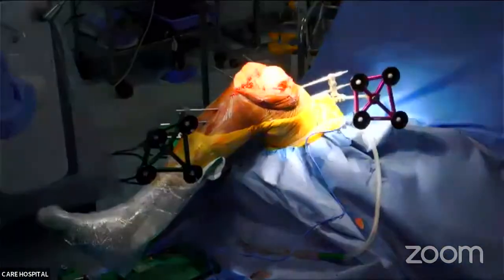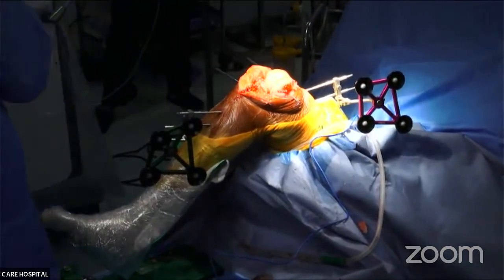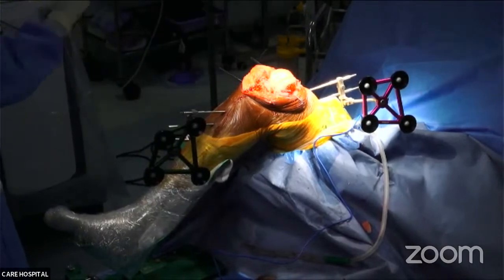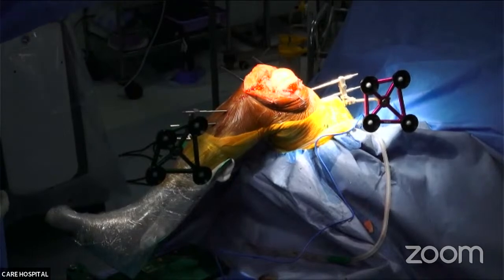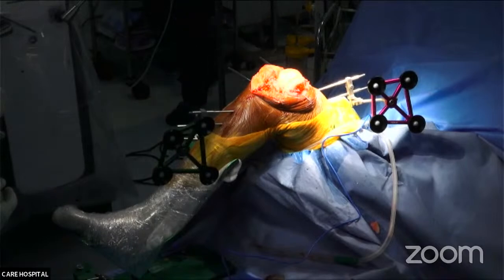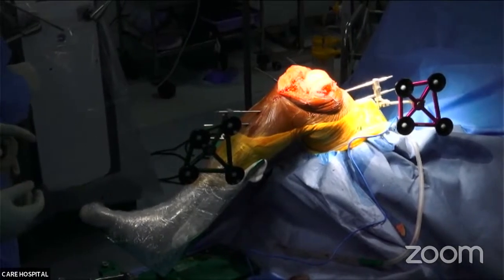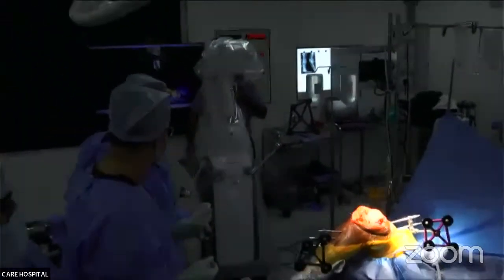Because the whole system, the OTS, is emitting infrared rays, and those infrared rays are being reflected back by the optical trackers, the cat's eye like thing, and those have to be caught again by the OTS. So they have to be visible. So OTS has to be placed in that way. And the pins have to be put in such a way that they do not come in the way of the burr.